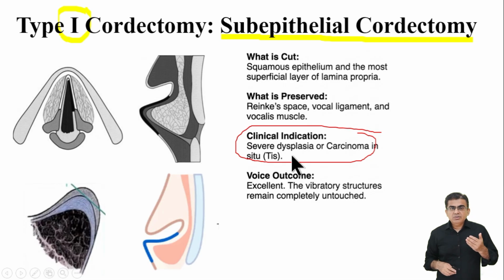I want you to remember our strict rule about taking biopsies. You must never use heavy cold steel forceps to simply rip or strip the delicate mucosa. That old stripping technique causes severe permanent scarring and completely ruins the voice.